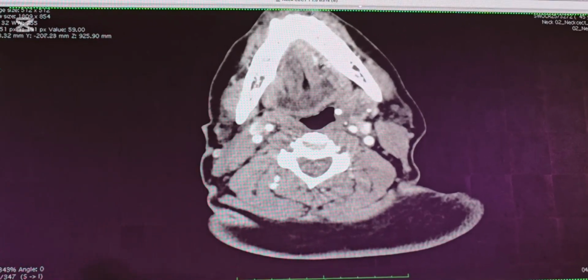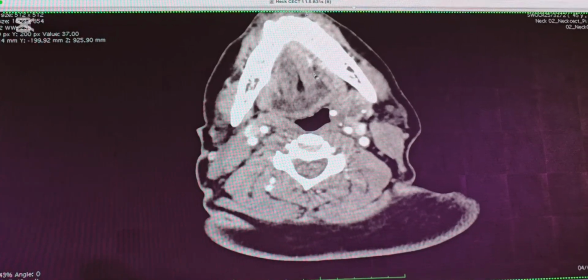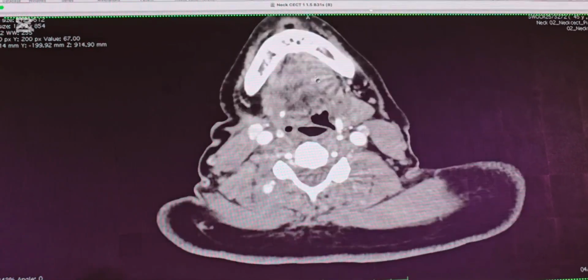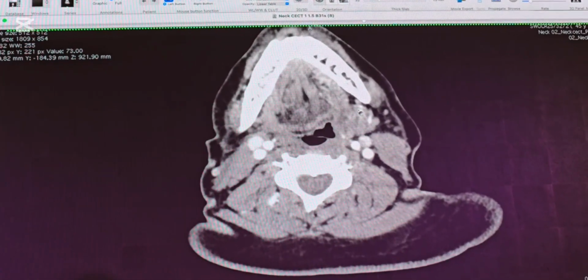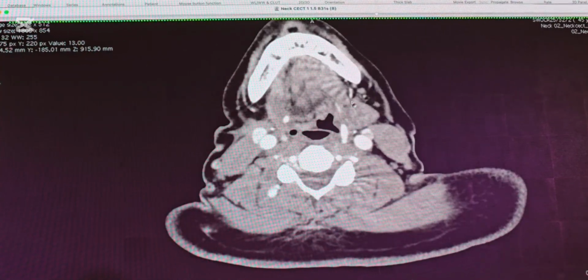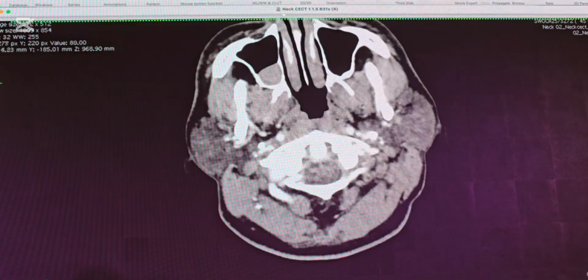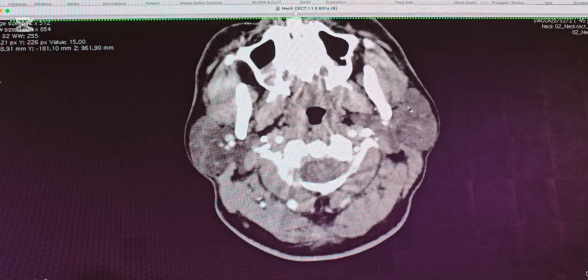Here when you see any abnormalities, swelling, edema, that is the sublingual space. When you come a little posterior, this area is the submandibular space, the submandibular gland. Is it clear? Can you follow? So I'm coming up. You follow the parotid gland. You can differentiate the tissue color. Coming down.